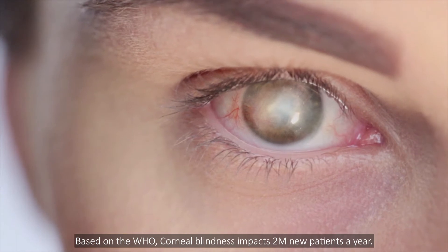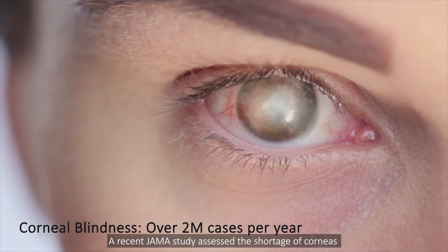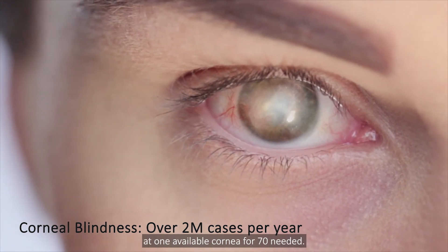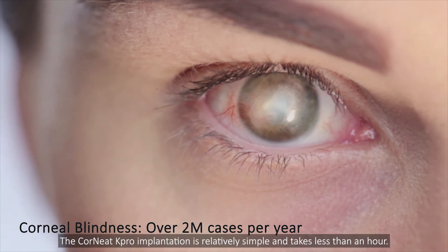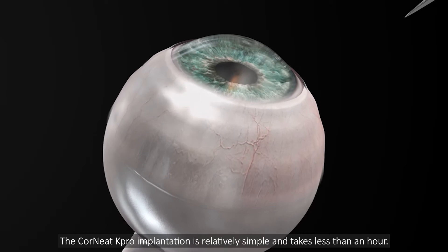Based on the WHO, corneal blindness impacts two million new patients a year. A recent JAMA study assessed the shortage of corneas at one available cornea for 70 needed. The Corneat K-Pro implantation is relatively simple and takes less than an hour.